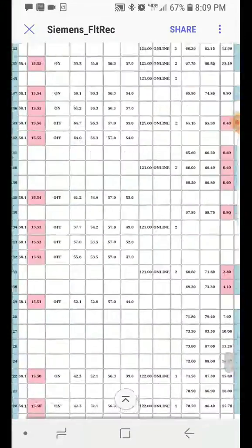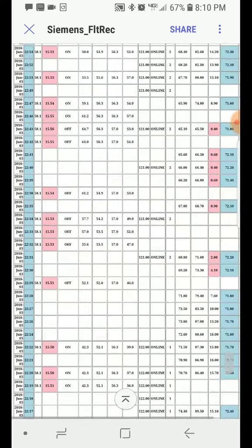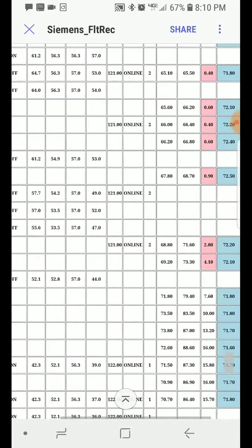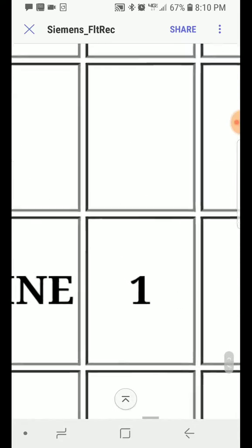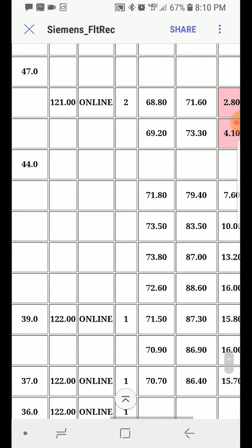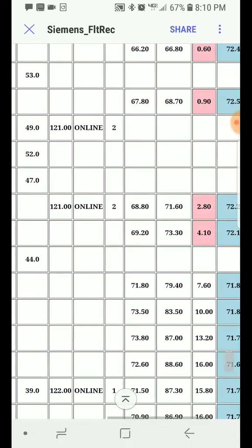Alright, there you are. Okay, so you can dig into the flight recorder and see what actually happened here. This looks like a power surge that was very quick, and everything came back online as soon as it happened. So the UPS is tracking power surges in numbers here in this column here. So when it switches to battery or it switches to like a surge protector, it tracks from 1 to 2, and you can see it went from 1 to 2.